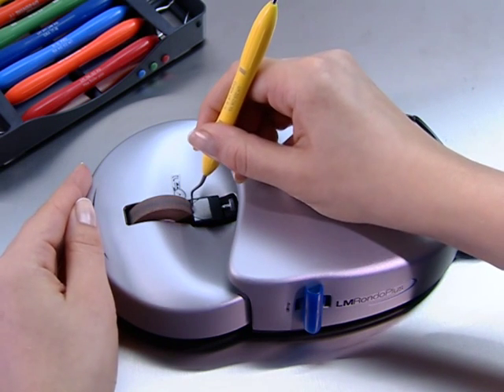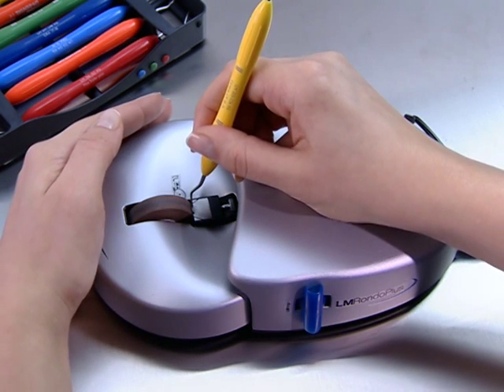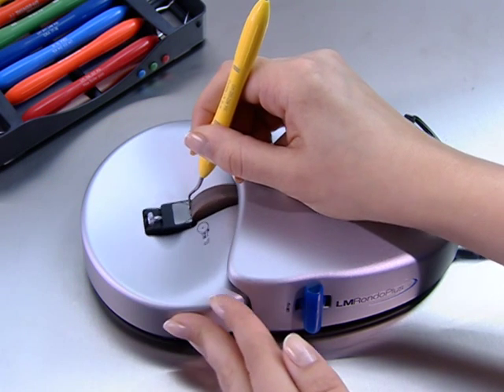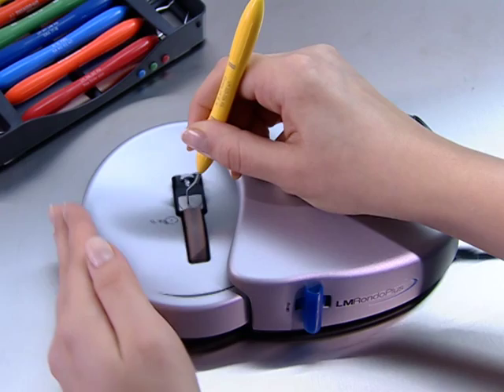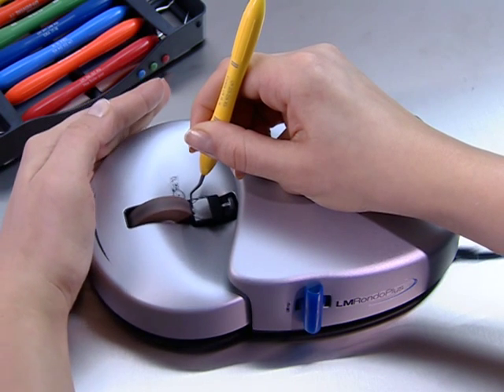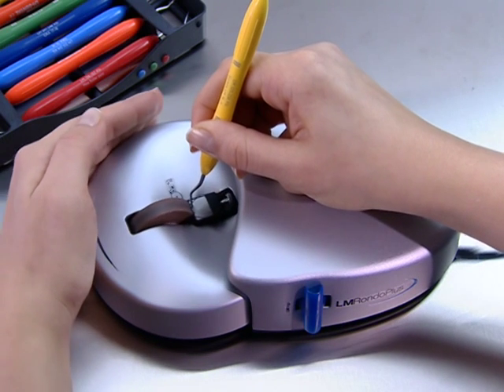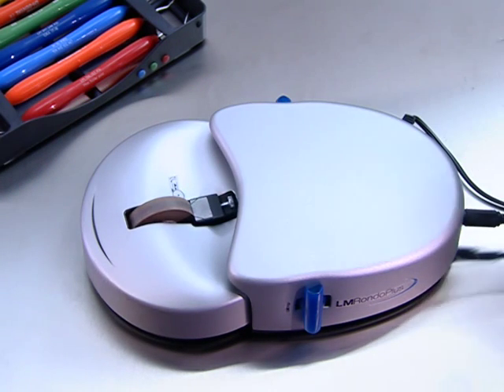A natural, relaxed grip on the instrument and a light contact with the sharpening stone provide the best sharpening results. The sharpener doesn't need to worry about all the complicated shank angles. The most important points to remember when sharpening are the instrument's lower shank and face, and their correct positions. Sharpening with Rondo Plus is easy, fast, and effective.